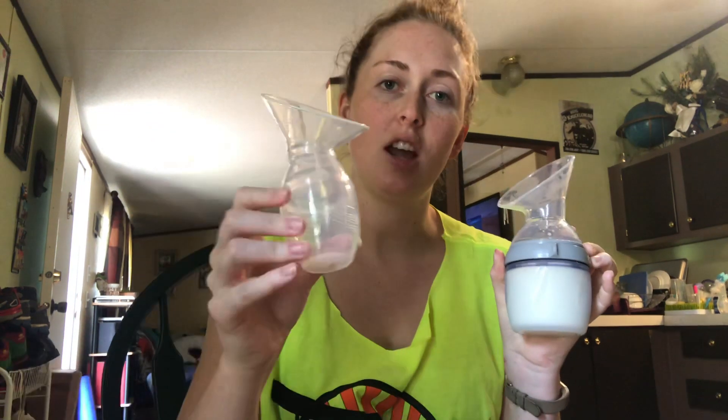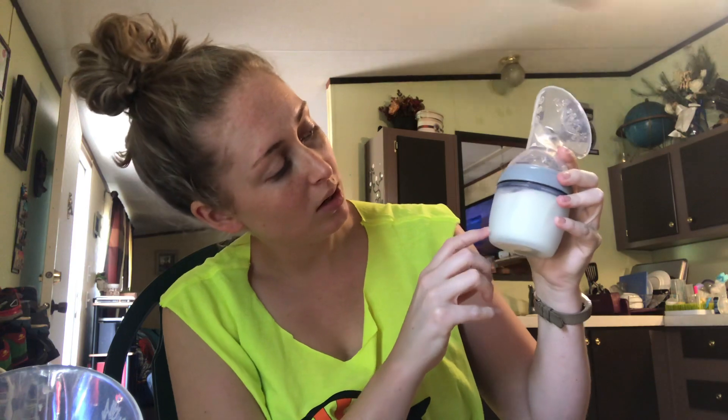But I was sent a generation three name-brand Haakaa that I just used for the first time, and I have got to tell you how amazing it is. This is the third generation, and this is the milk that I collected from both sides. I used this on one side and the other one on the other side. This bottle holds a hundred and sixty milliliters, a little bit over five ounces.